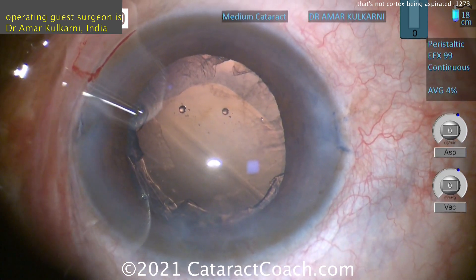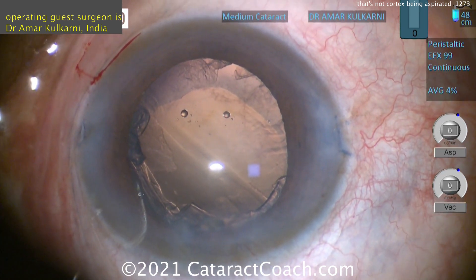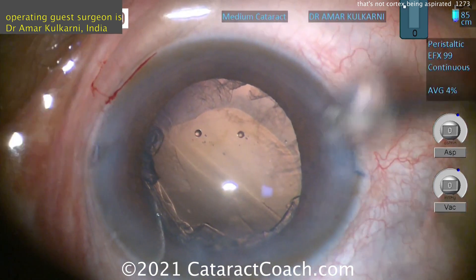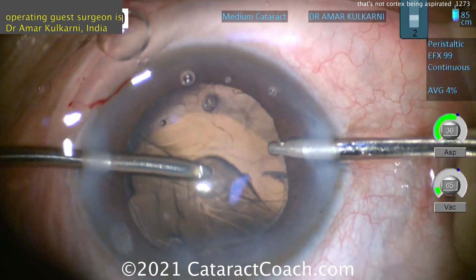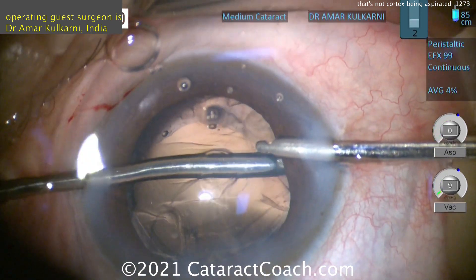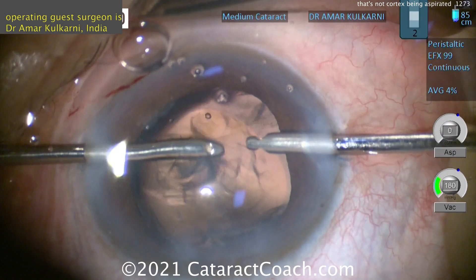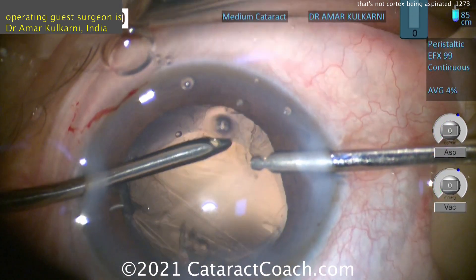This looks like HPMC — hydroxypropylmethylcellulose. You can still try to clean up some of the cortex now, or you can put the CTR in. The catch with the capsule tension ring is that if you put it in, it can also trap some of this cortex in the capsule bag at the equator. Because that outward force of the CTR is going to push this cortex out towards the lens equator or lens periphery.